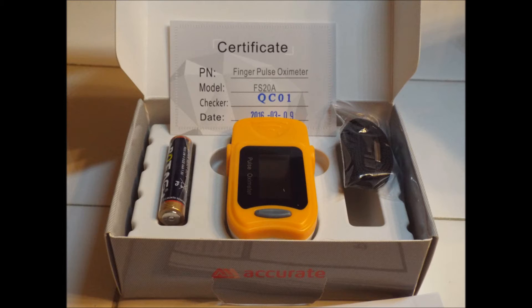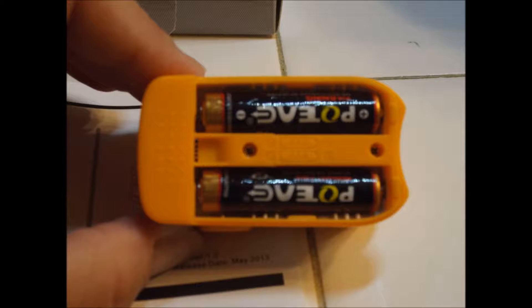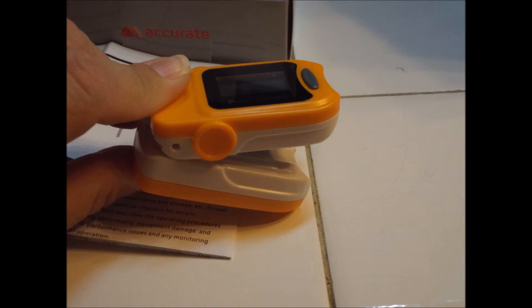The pulse ox comes with everything you see here. It's super easy to put together. I got it because my daughter and I are both prone to pneumonia since we have asthma. All you do to put it together is slide the back off, put the batteries in, put the back back on and slide it on your finger. Easiest it can be.